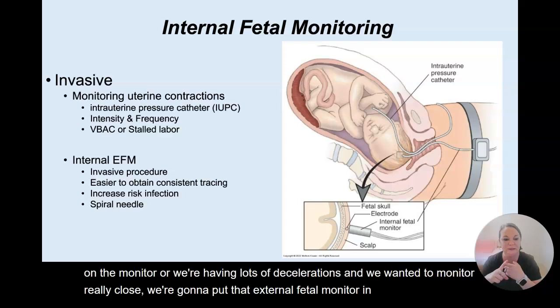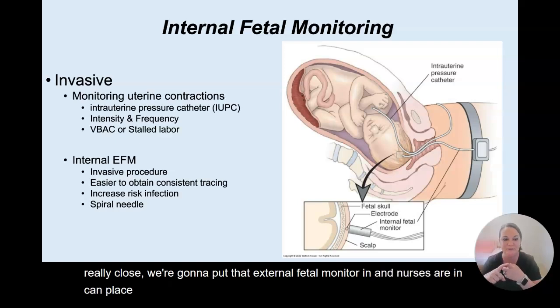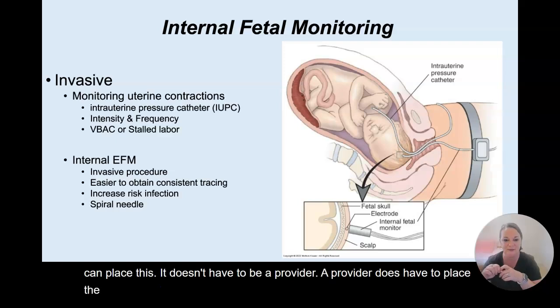And nurses, RNs, can place this. It doesn't have to be a provider. A provider does have to place the intrauterine pressure catheter, though.